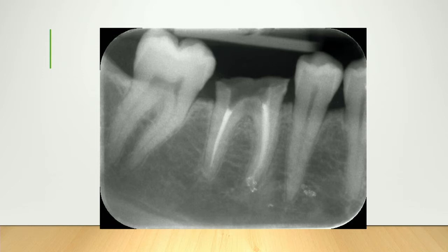This is a fairly straightforward surgical extraction. So how I would approach this, I actually wouldn't necessarily raise a flap. I would just go straight for sectioning, and I would start sectioning from the furcation upwards, okay? And after you section, in some cases, you put a luxator down in the middle, and it may still not have enough mobility for you to remove the roots. The reason is that it's root canal treated, and there's hardly any periodontal ligament. So you don't have very much periodontal ligament in there. Therefore, in these kind of cases, you have to drill.